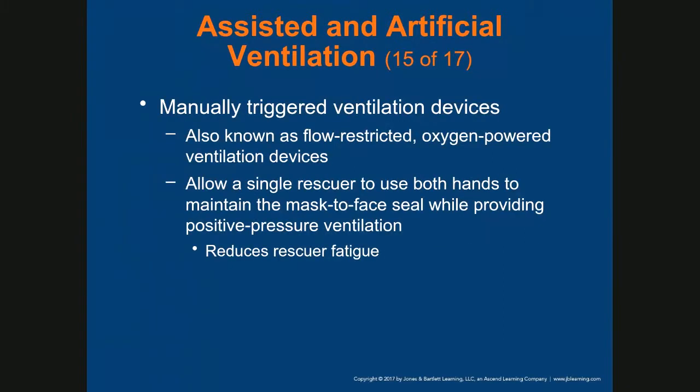Now, ventilation devices, you're not going to see that much in your system. I won't mention a lot on ventilation devices, but all it is is a machine that is creating the ventilation for the patient, based on the settings that you put on the machine. Some machines are manually triggered, meaning you have to press a button after you put in the settings and it creates the ventilation. And some are automatic. You just put in the settings and it automatically ventilates the patient.